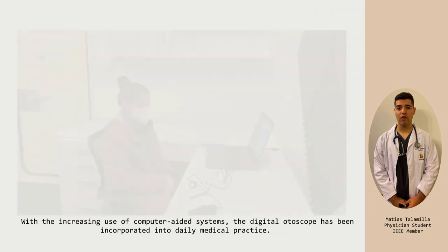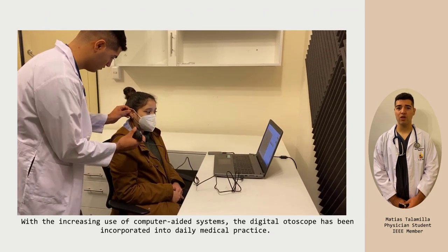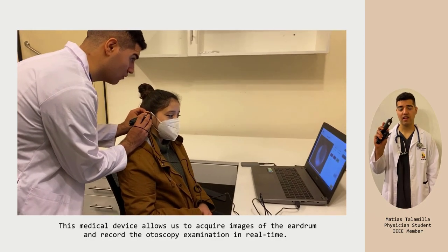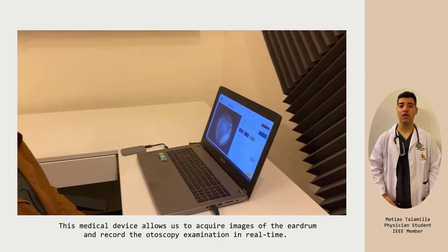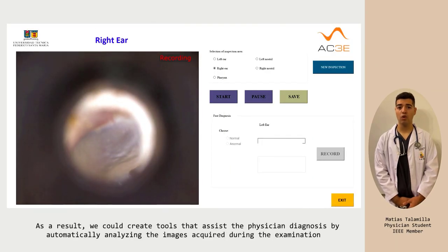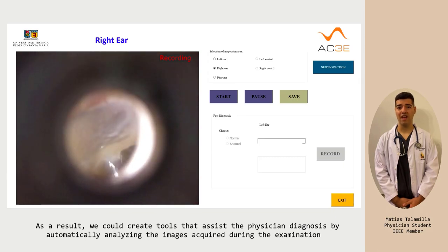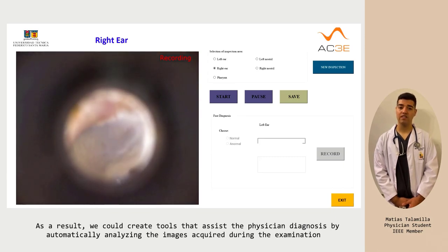With increasing use of computer-aided systems, the digital otoscope has been incorporated into daily medical practice. This medical device allows us to acquire images of the eardrum and record the otoscopy examination in real time. As a result, we can create a tool that assists the physician's diagnosis by automatically analyzing the images acquired during the examination.